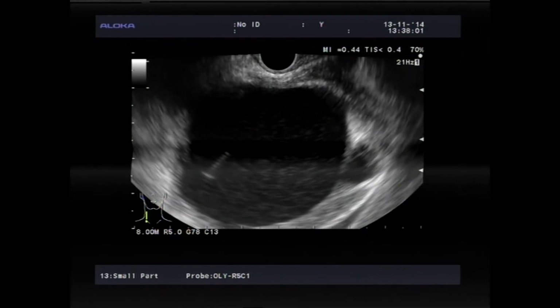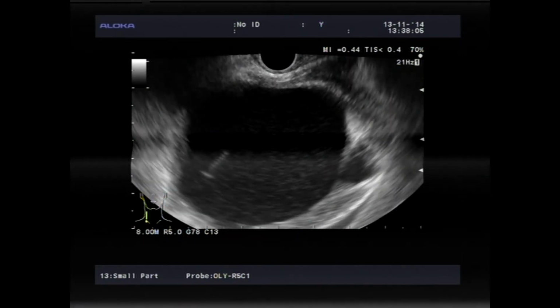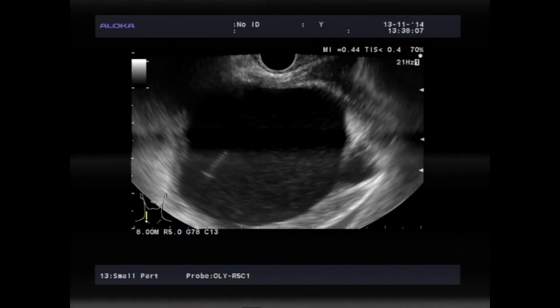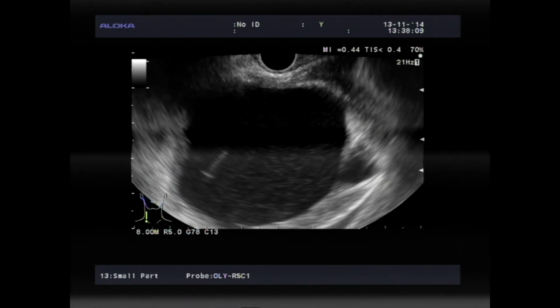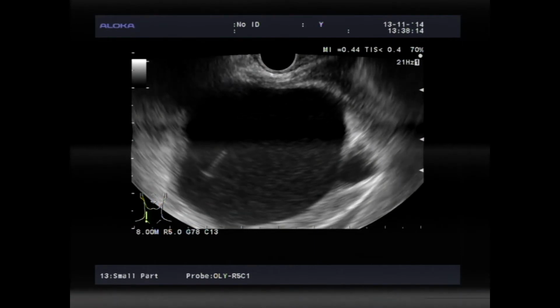But you have debris inside. So if you want to treat, probably the best way is to place a metallic stent or two plastic stents. Two plastic, yes. So I think we have what we need.